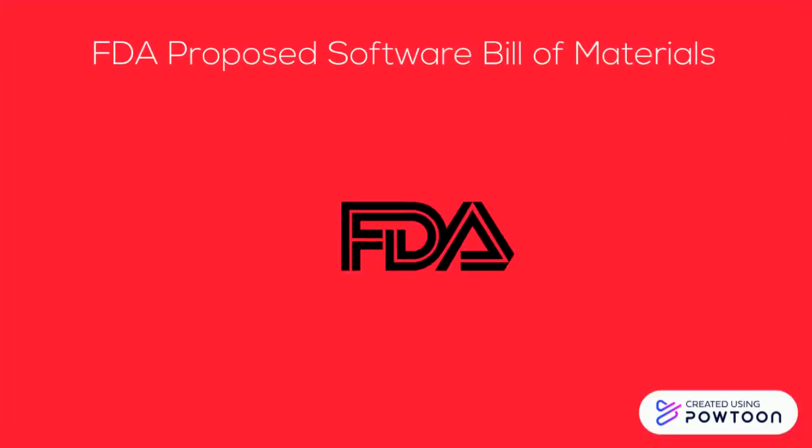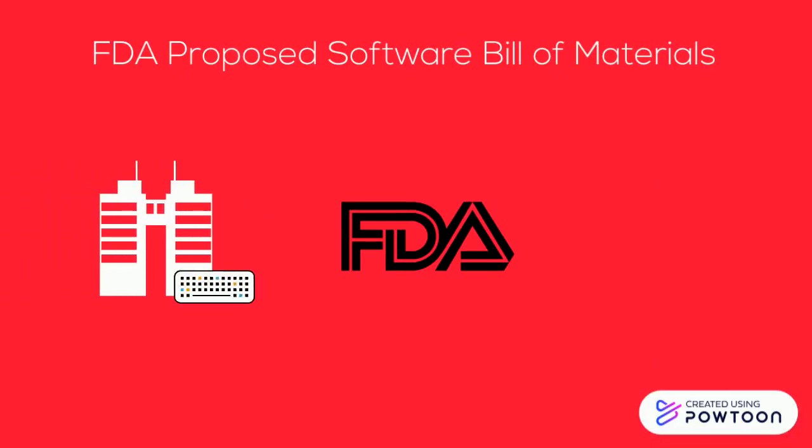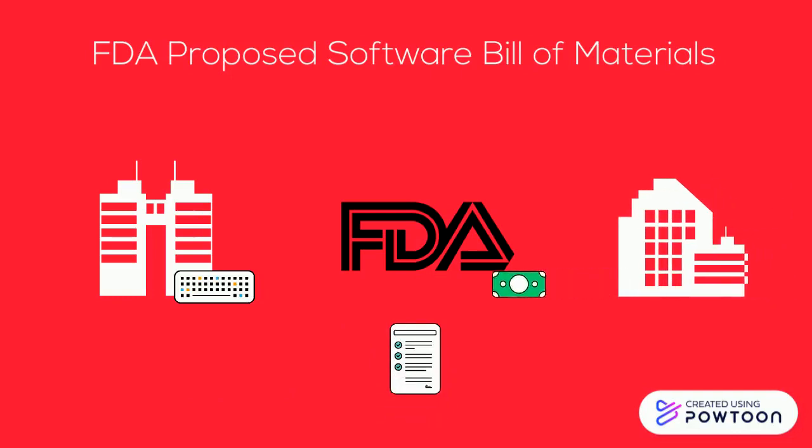The FDA is exploring requiring the medical device industry to submit a software bill of materials as part of its review process before a device is allowed for sale. This is to ensure medical devices are resilient to cybersecurity threats.